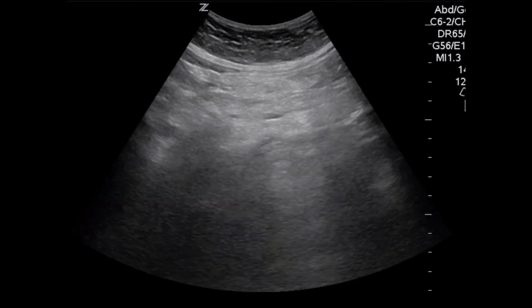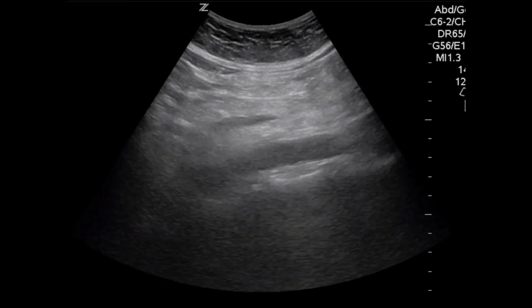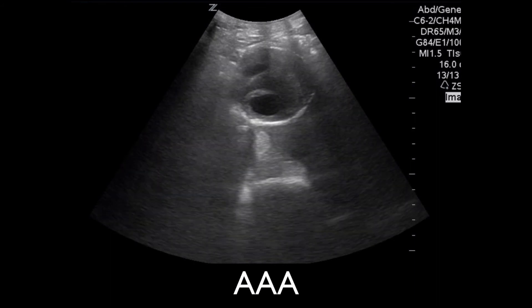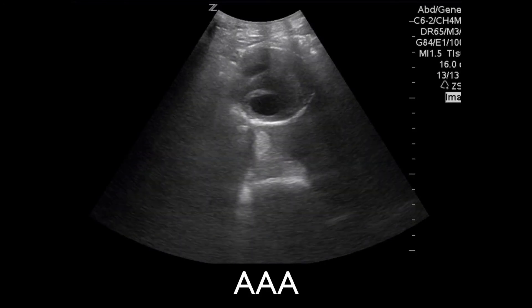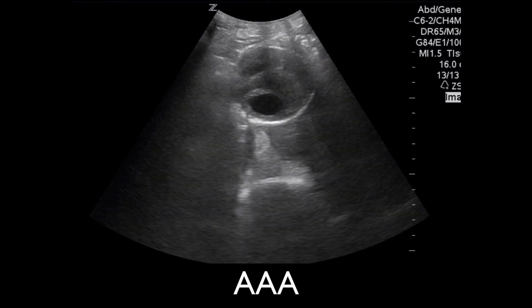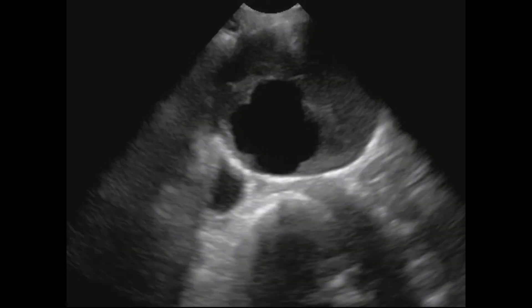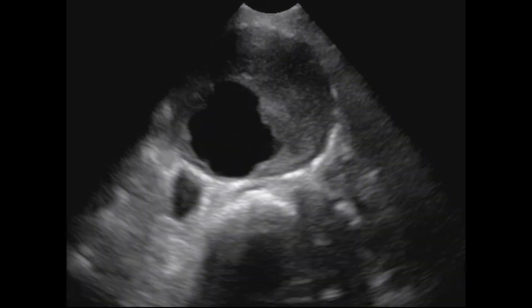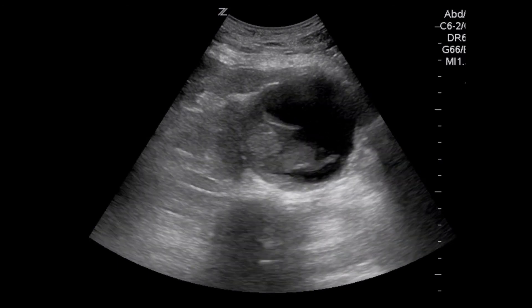You can evaluate the aorta in long axis with the indicator pointed up towards the patient's head. Here you see the vertebral body bright at the bottom and the aorta as the tube on top of it. You can measure it along its axis or use hash marks on the side. One example shows the vertebral body and then a large circle — the whole thing is the aorta. The small anechoic portion within it is the lumen where blood flows; the rest is clotted blood — this is an aneurysm, about four or five centimeters. Another example shows a large thrombus plus lumen, a large AAA. And another with floating clot — a really dangerous, big AAA.